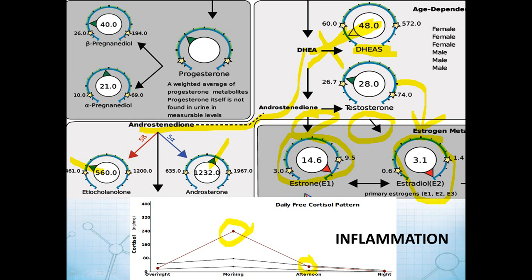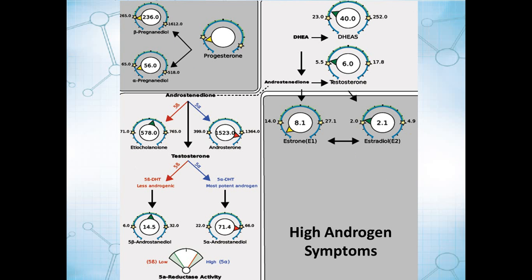So that'd be a good patient to follow up with maybe a CRP or some of these inflammatory markers, and something that if you can address the inflammation, it may actually significantly alter this profile. But if you don't have all of these different metabolites, it's hard to piece all of this together.